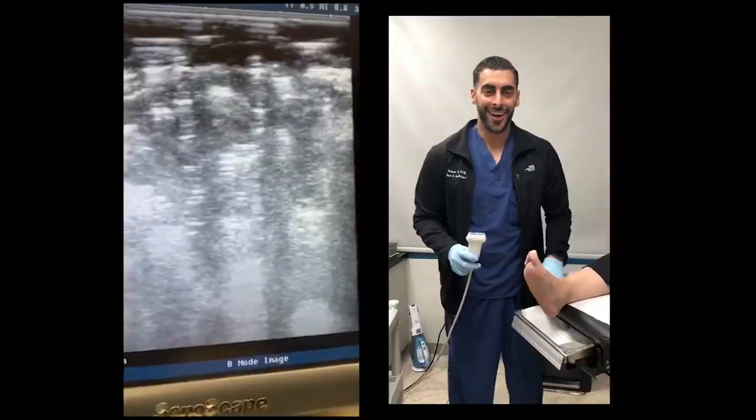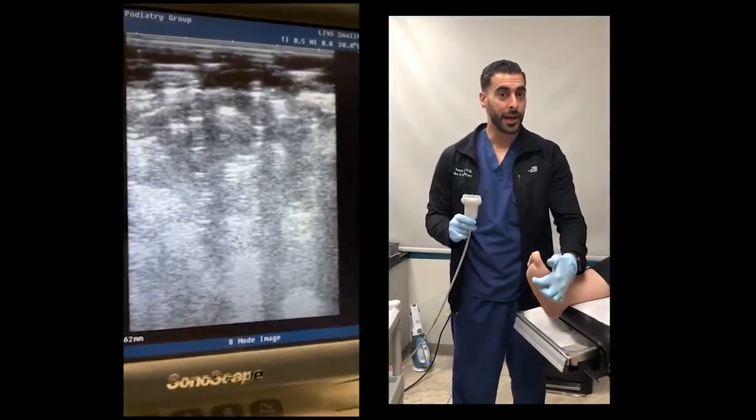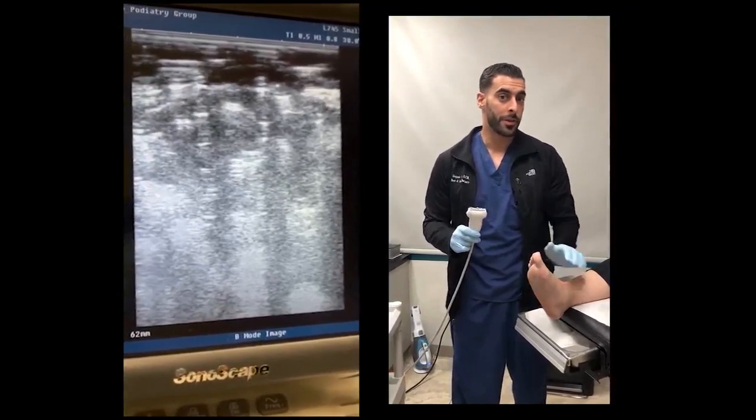Now, when it comes to injury and pathology of the sesamoid apparatus, it's helpful to think about it in 4 different categories. Acute, such as with an avulsion fracture; chronic, as in the cases with repetitive stresses or chronic sesamoiditis, or anything that's affecting the medial or the lateral support structures of the sesamoid. And now, I'm going to show you guys how you can use an ultrasound in your clinic to make that diagnosis, as well as identify any pathologies.